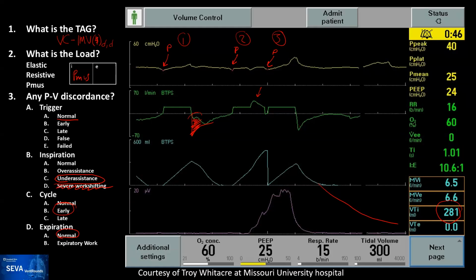Rob? I have seen one patient on NAVA that was showing no EDI signal, but was triggering the ventilator. And that was because the patient had a known diaphragmatic paralysis and they were triggering with accessory muscles. So it can happen. Yeah, that could be, I mean, that's another thought, right?